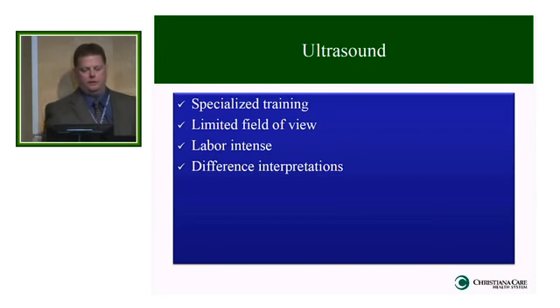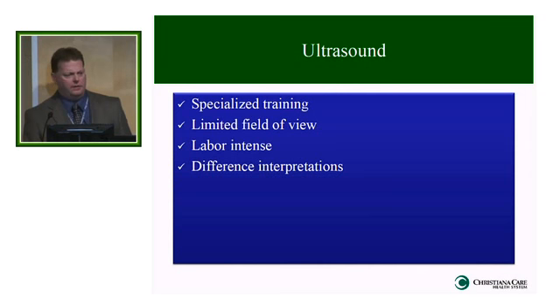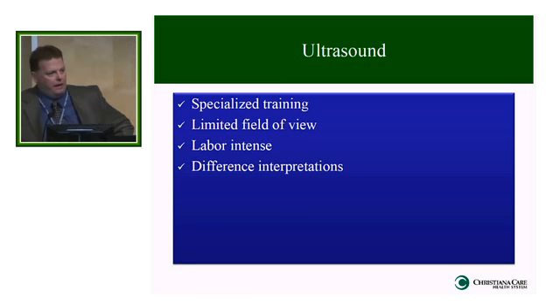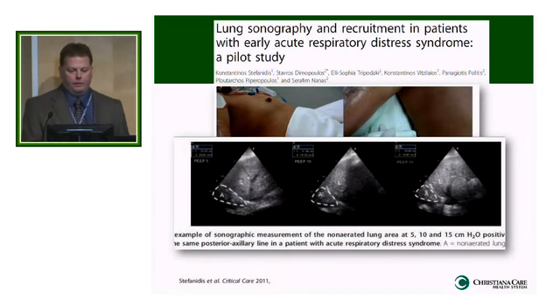Ultrasound, this is kind of interesting. It takes specialized training. You get a very limited view, it's labor intense, but I thought interesting nonetheless. So what are we talking about? Looking for those areas that are bad in ARDS. They felt in this study that they had experts who could look for the lung that's not recruited, and then you could do maneuvers to recruit it and watch it on ultrasound. Kind of an interesting concept.